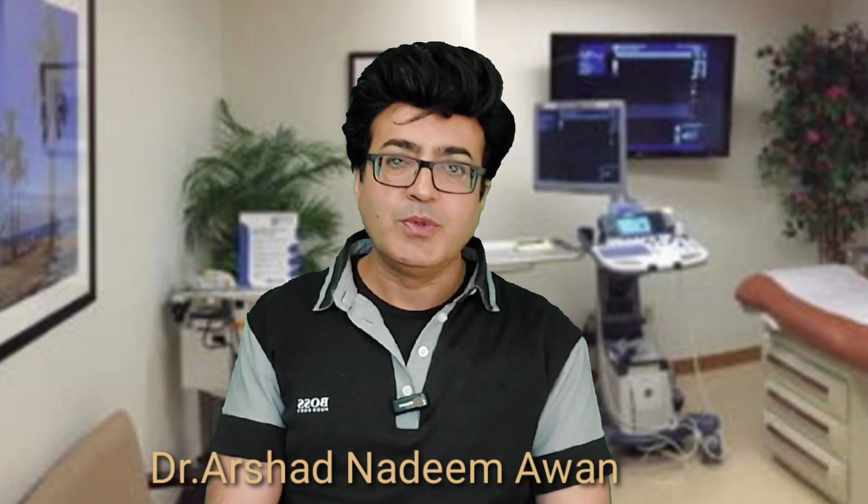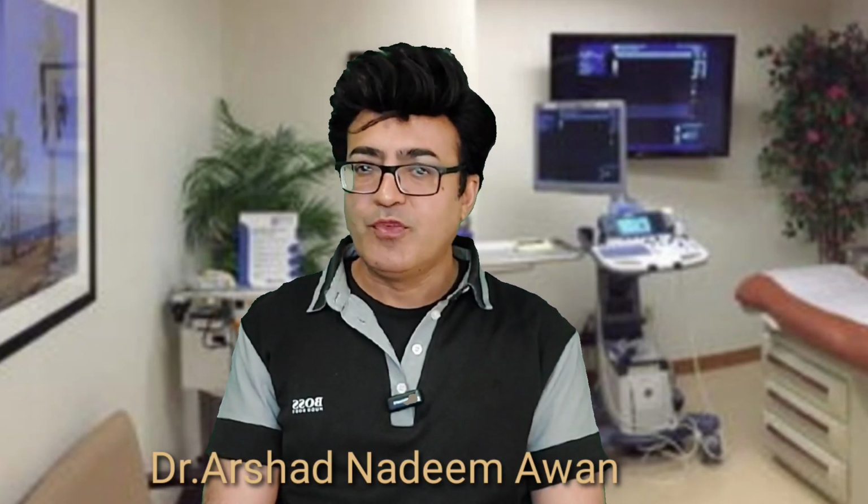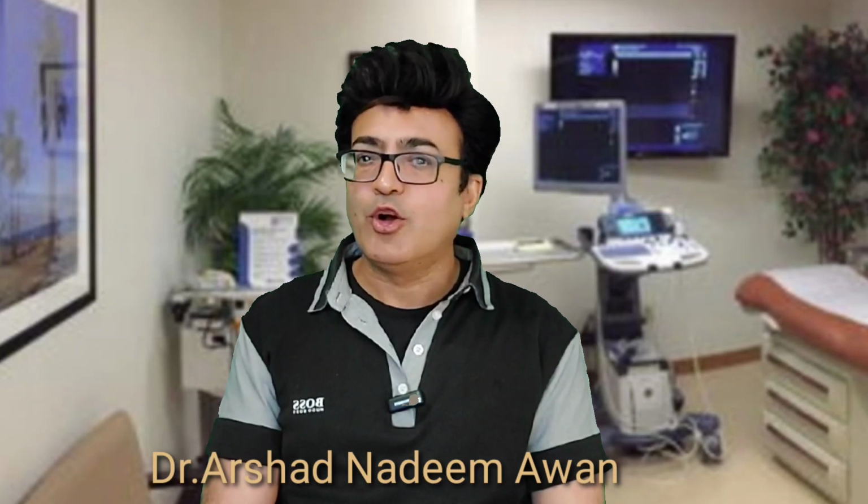If there is no nodule at all in the thyroid, it will be considered as U1, and if there is a benign nodule, that would be called U2, and if it is indeterminate for cancer, that would be called a U3 nodule, and a U4 nodule would be suspicious for cancer, and U5 would be a definitely or clearly malignant nodule.